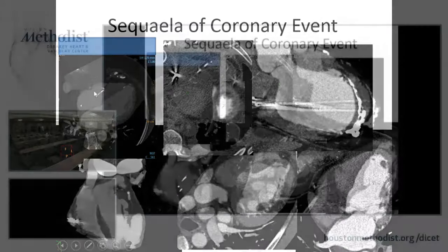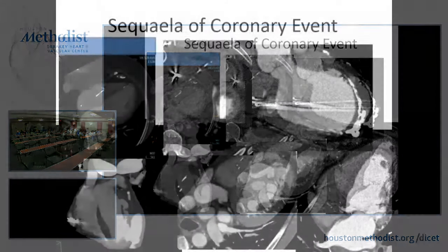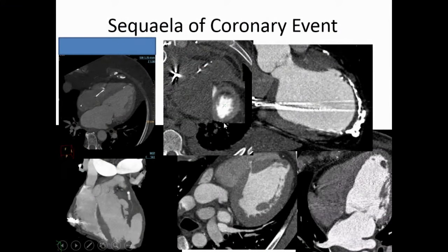No. It looks like there may be either some sort of calcification or... Correct. Yeah. So number one, it is a little bit thinner. Yes, okay. So this per se is a very important finding, especially if you have a study with not so good quality. Same here, okay, this is the fat infiltration. It's very typical after myocardial infarction. And in some extreme cases, instead of fat infiltration, you get heterotopic calcification, like here, in a patient with extensive anterior MI.